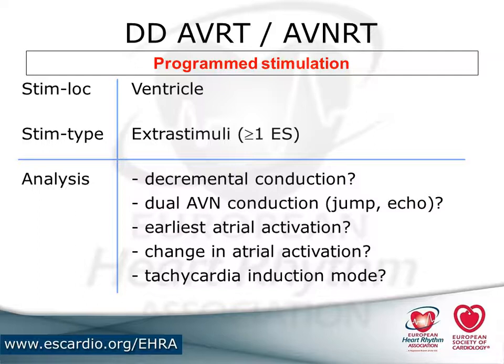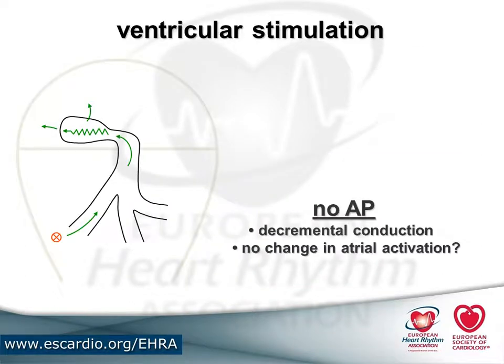So you know what the left atrial activation is. You can basically cover the mitral annulus, where far more often the pathways are left-sided, as I showed you in the schematic. And if you have a high right atrial catheter, then it tells you if the right side is early. But you could also use your map, so you could maybe save a catheter.